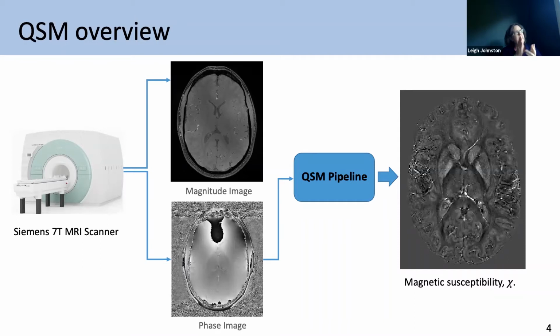What is it doing? There we ask the question, if we have a non-zero phase, what does it tell us about the underlying tissue? In a human brain, there aren't that many things that can cause observable off resonances to the point that you get these phase differences. I'm not talking about little NMR type peaks around the water peak, right? They are unobservable to us. We just don't have enough field strength for that. But when you think about iron being present in the brain, that is enough of a resonance frequency change to our proton signals that we can actually detect it.